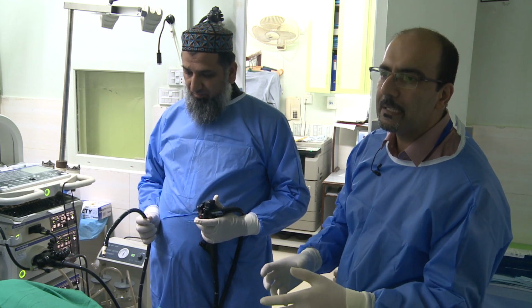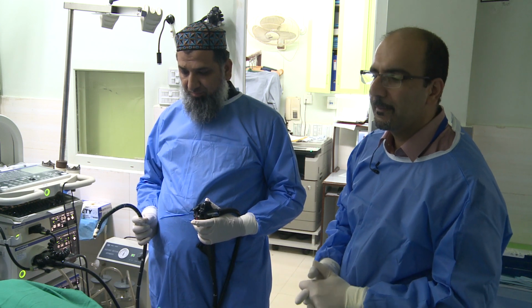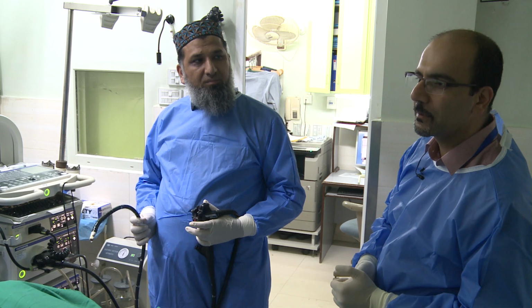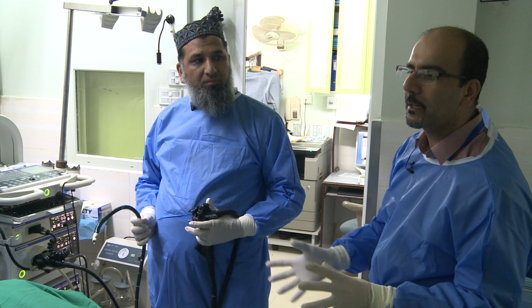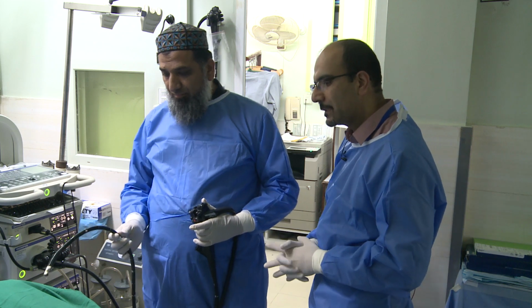The lesion clearly is not endoscopically resectable, but we can look for lymph nodes, we can look for liver mets. We can try and study the lesion, but it's very friable. I remember just touching it with the ERCP scope, it was oozing. So we may look at it to show the audience, but we may not necessarily go to the second portion and do an EUS there. It's in the patient's best interest.